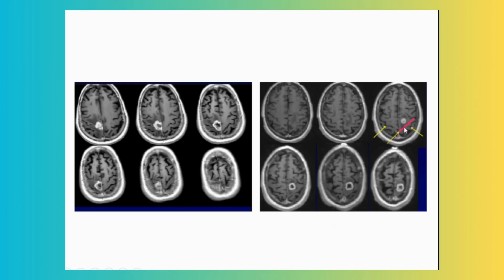So again, for example, localizing this tumor. Before localizing this tumor, where it is, because this is the frontal lobe and this is the parietal lobe, it's very important to identify the central sulcus sometimes. So we put a line on the central sulcus, and the tumor is in the precentral gyrus or motor cortex. It's in the frontal lobe, not behind it, which would be the parietal lobe.